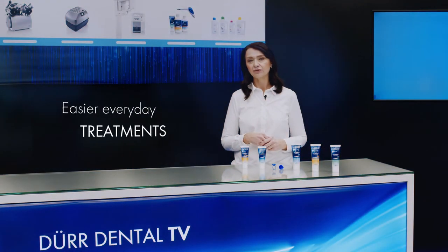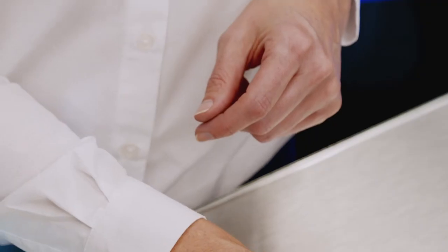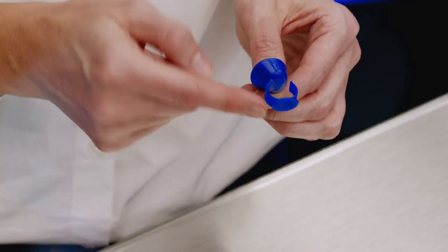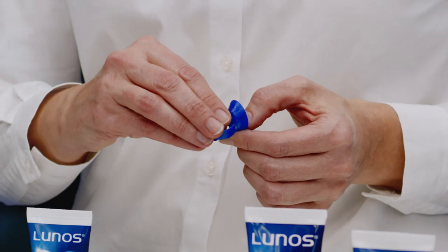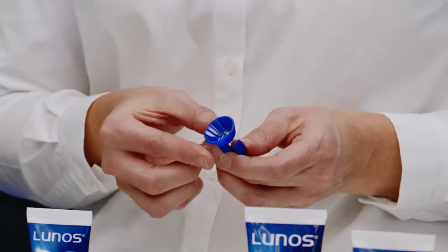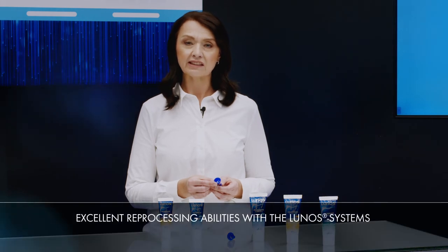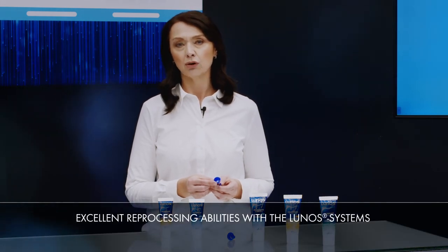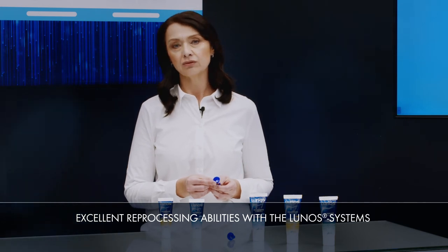The prophylaxis ring is a small accessory designed to make your work more ergonomic. The practical foot allows the paste to be positioned on the tray, ready for use. The Prophy paste holder has no edges, making it easy to clean. As reprocessing abilities are an important part of the LUNOS system, the prophylaxis ring can also be thermally disinfected and sterilized.